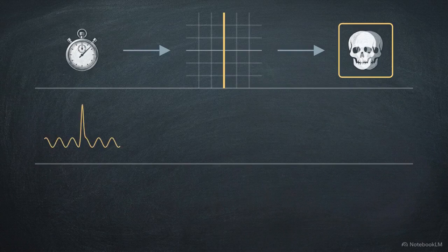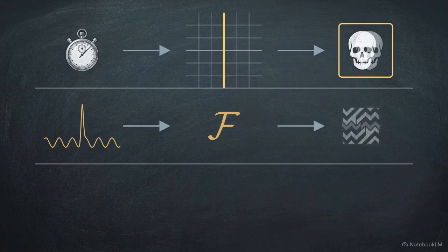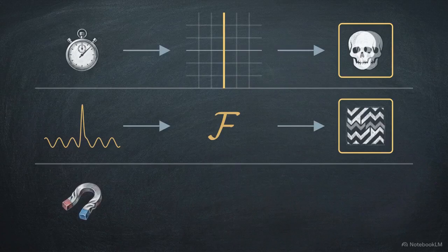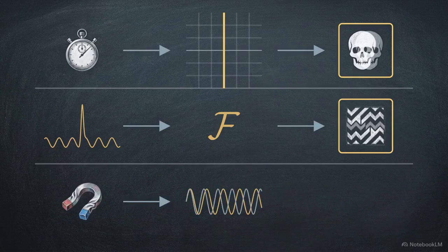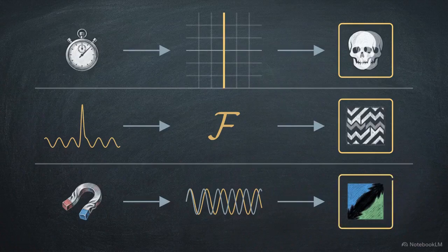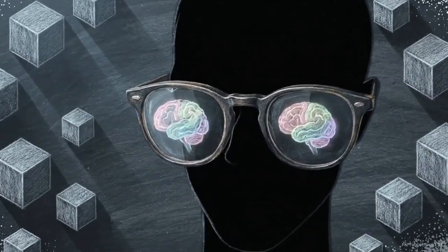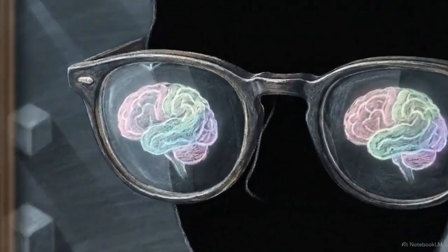Rule 2. If the error is global and geometric, the failure occurred during data collection. Spikes or truncations in K-space translate into systemic Fourier distortions, like the herringbone or Gibbs artifacts. Rule 3. If the error involves signal voids or positional shifts at tissue boundaries, the local magnetic field has broken down. These inhomogeneities trigger Larmor frequency shifts, causing chemical shift and fat-water cancellation. Mastery of MRI physics means recognizing the precise moment mathematical models collide with physical reality.